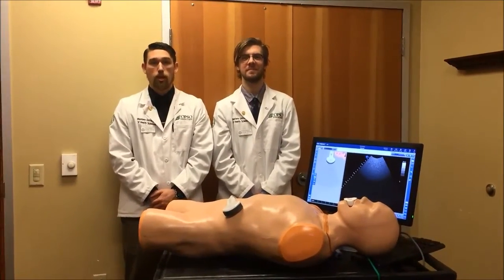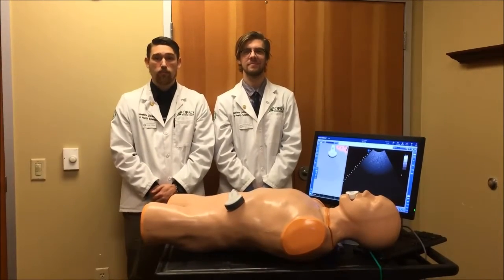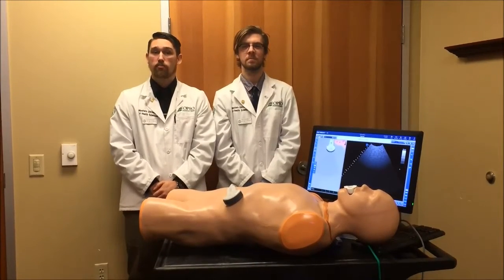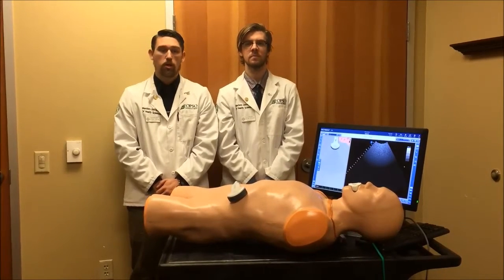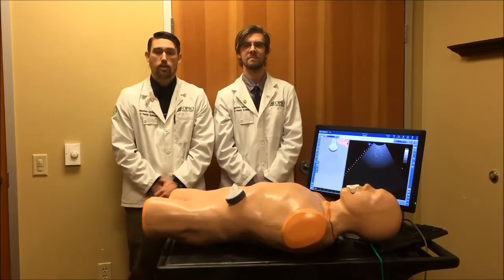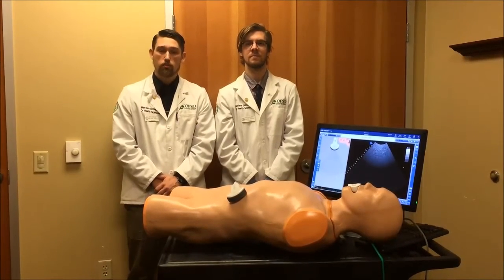Today we will be demonstrating how to identify cardiac structures using the CAE Vimedix ultrasound simulator and a curved array probe. We'll be identifying cardiac structures from three separate views: the subxiphoid view, the parasternal long axis view, and the parasternal short axis view. We will identify different anatomical landmarks in relation to the cardiac chambers and valves of the heart.